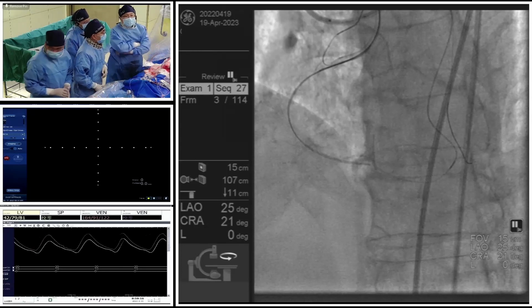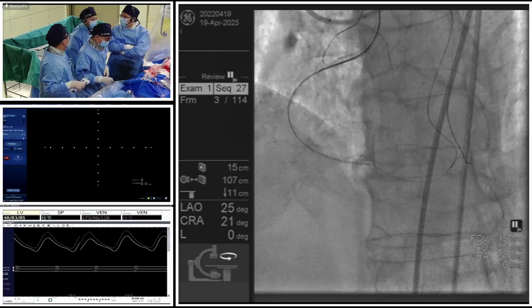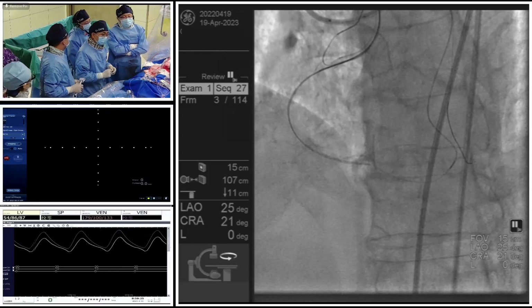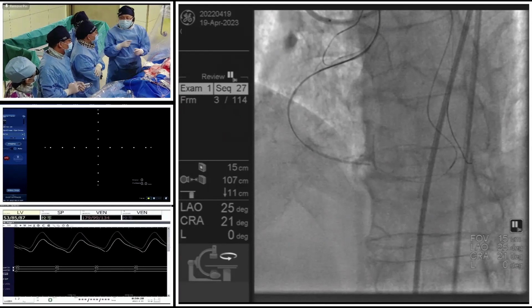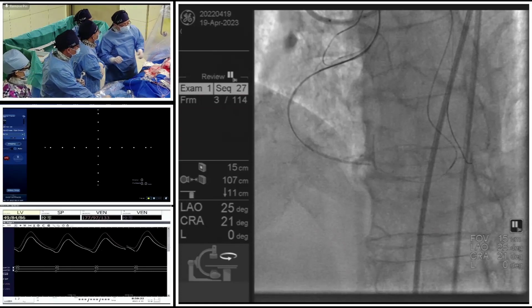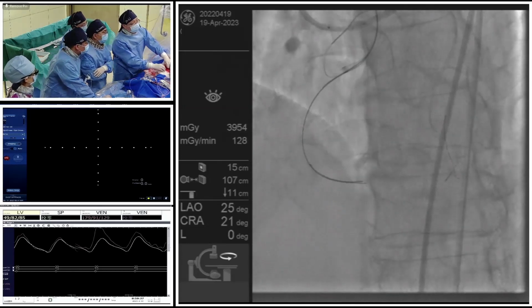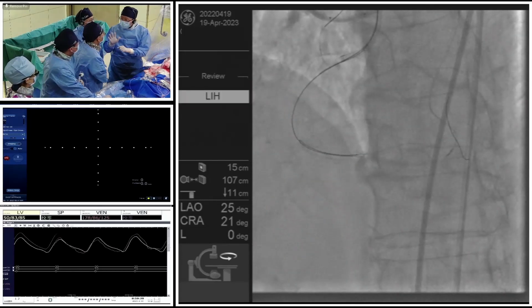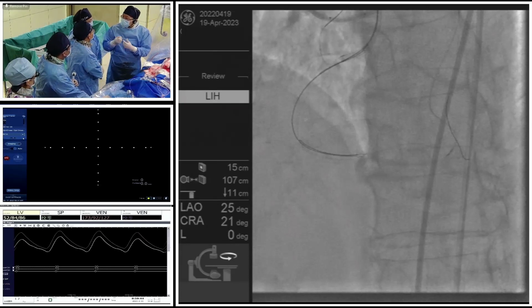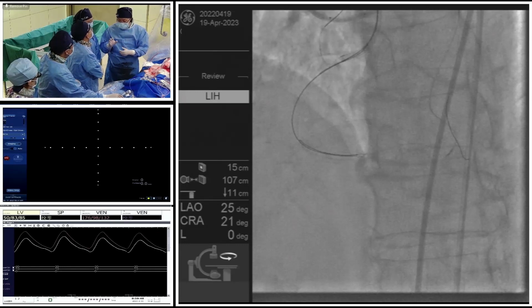Yeah, I know Professor Lee has a series of studies about this one. It's called successful occlusion by absorbable sutures for epicardial collateral branch perforation. So for distal vessel perforation, sometimes we like to use silk suture, silk suture with small fur on the surface of the suture. So maybe it is better to embolize the perforation.